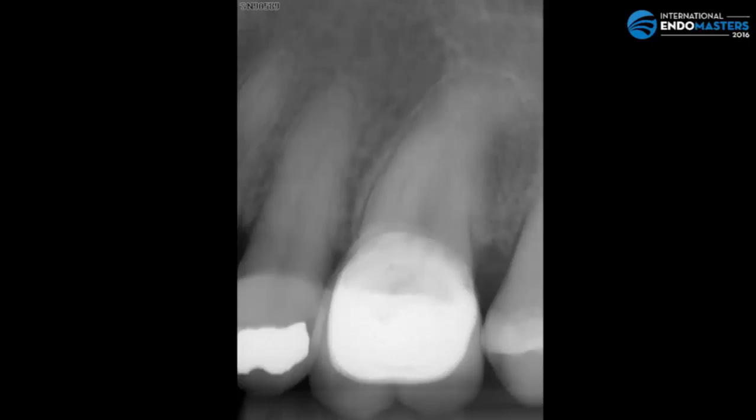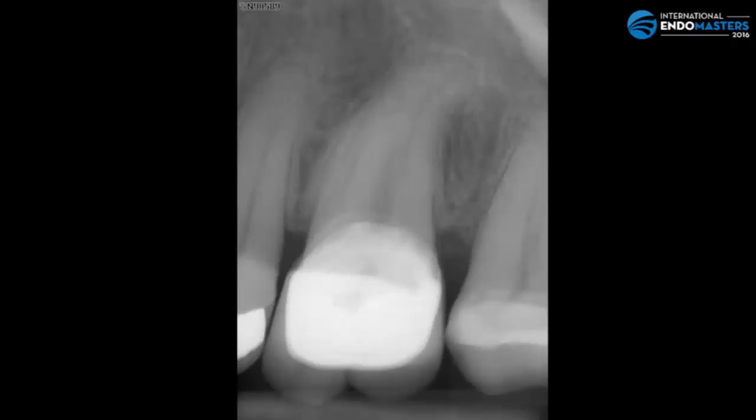This patient is a very important person in my life. He is my cousin and he's an engineer who helps me fix problems in my office and never charges me. He had this crown recently placed on this maxillary molar. He started feeling lingering pain that increased as time passed until the pain became unbearable. At this point, we decided to start a root canal.